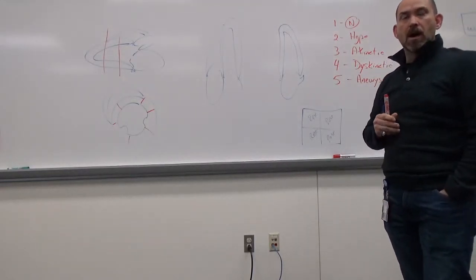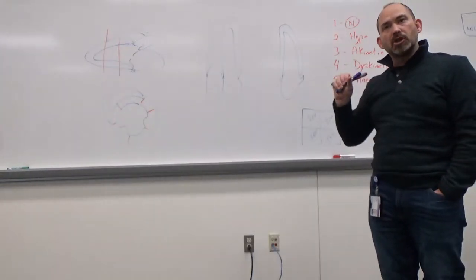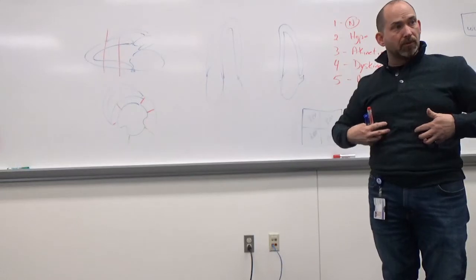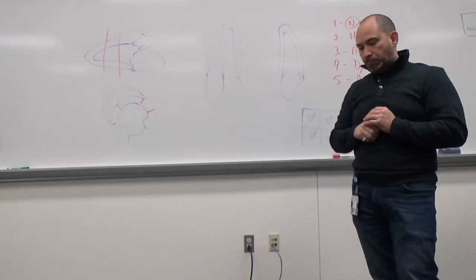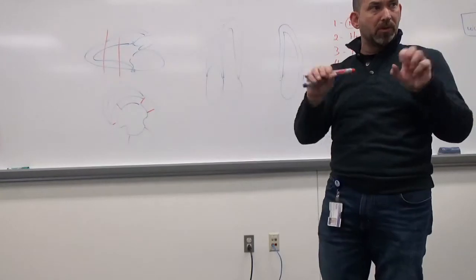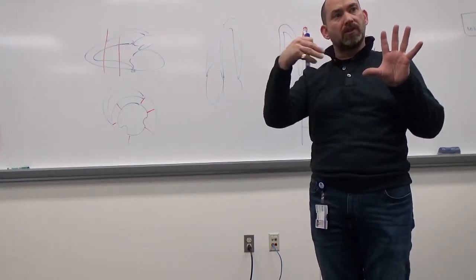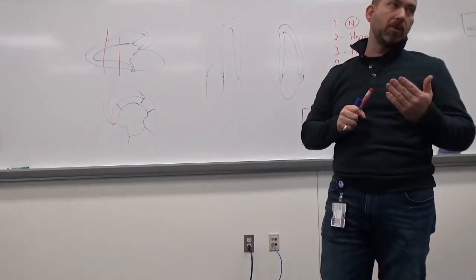When we use these microbubbles, because they go through capillaries and stuff like that, well, it'll go into the chamber, but it can also go into the walls. So if we're looking at like a liver, for example, we put contrast in it, you'll see actually all the little capillary beds will light up. There's actually a trigger on most ultrasound systems now that you press the trigger and it bursts all the bubbles, and what it does is it puts a very high power output for a few moments, and it destroys all the bubbles, and then it resets itself, and then you'll see it fill up, and it starts a timer to see how long it takes to fill that up.